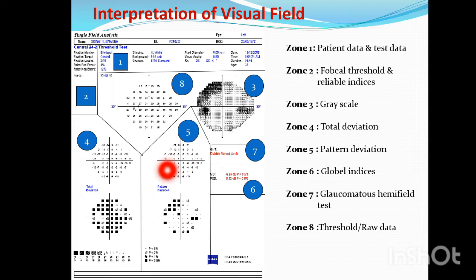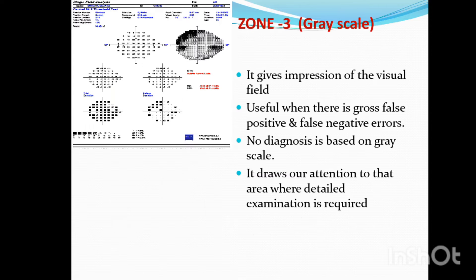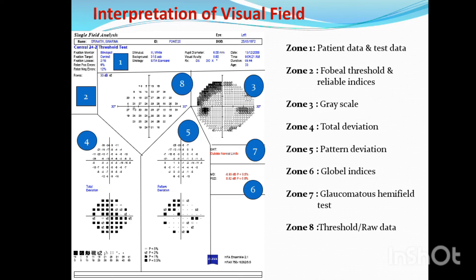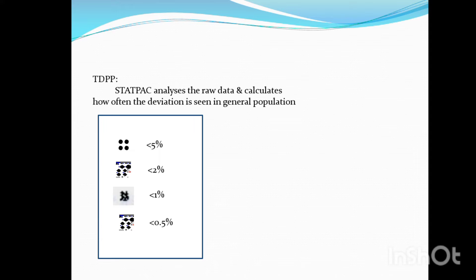So this is the probability indices. The probability indices are less than 5%, less than 2%, less than 1%, and less than 0.5% of the population. Meaning that the darker the symbol, the more statistically rare and significant the depression — less than 0.5% is very rare in the normal population.